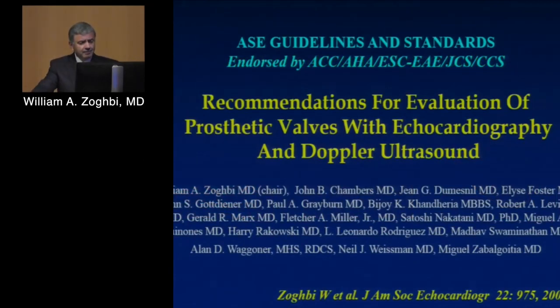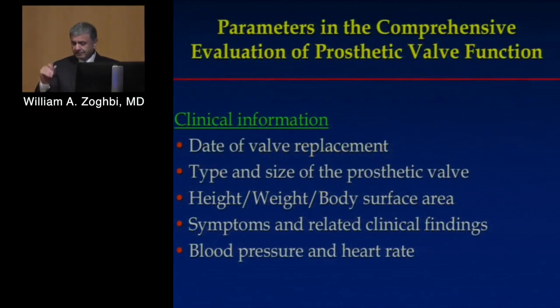I was privileged to chair this document. That was actually the first document, a few years ago, assessing what normal values are but, importantly, how you evaluate prosthetic valve function, be it stenosis or regurgitation. And I think this still holds; you're not going to see an update of this for quite some time. What you will see within the next year, probably 2 years, is an update, and I know Paul is on that document, on percutaneous procedures, and how you evaluate regurgitation, which is a difficult topic to start with.